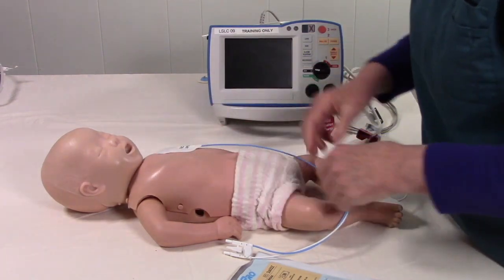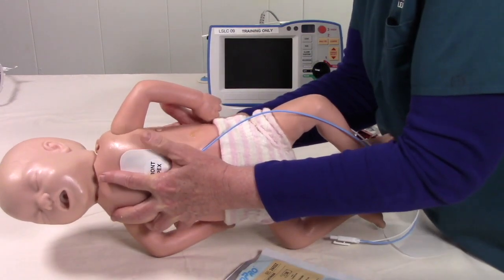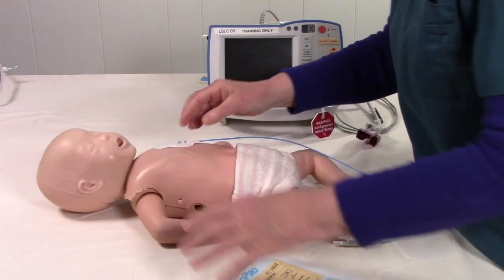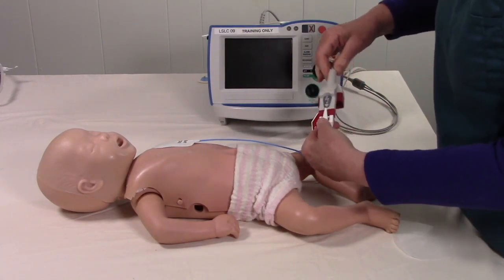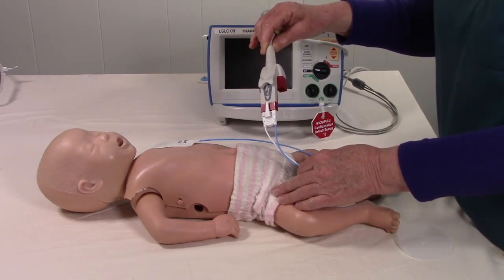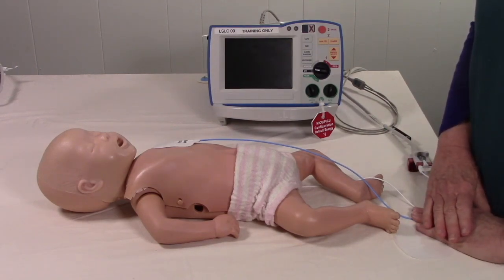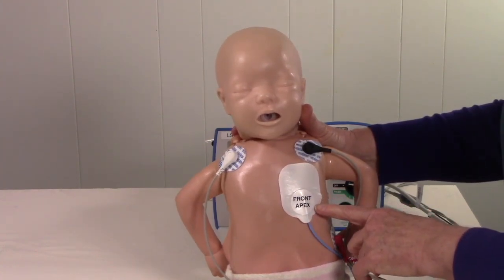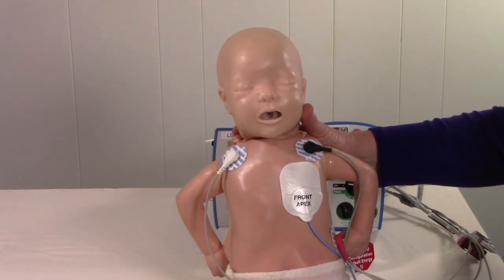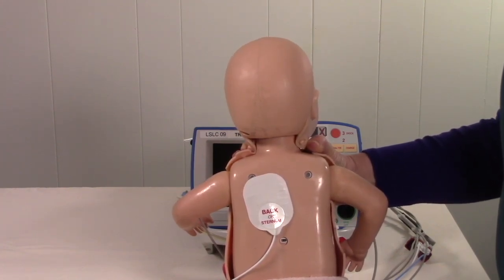Place the first pad, then roll the infant over and place the second pad on the back, then lay the infant on their back. You will then connect them to the therapy cable. This is the frontal view of the Mini Infant Pad placement with ECG electrodes on as well, and this is the back view of the Mini Infant Pad placement.